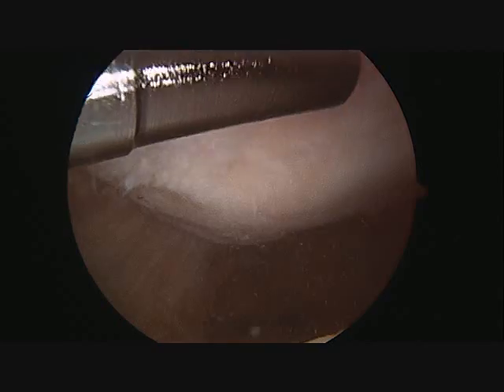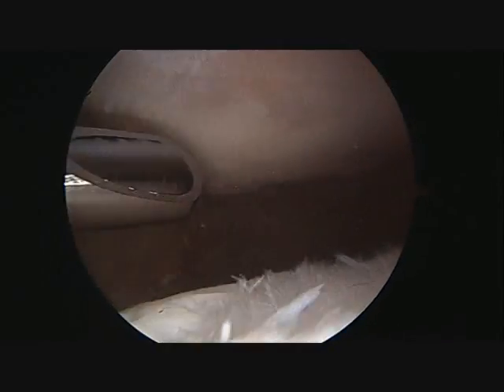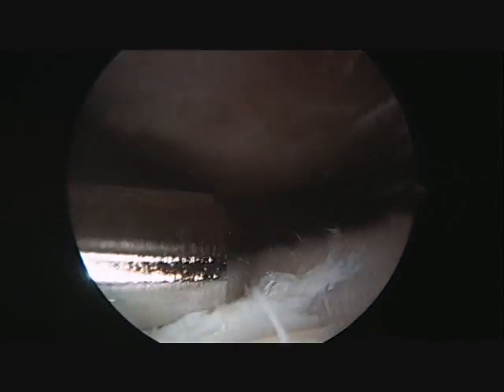The shaver is placed into the knee, and the rough edges are smoothed down to remove any loose debris, so as to eliminate a potential site for loose bodies as well as to reduce pain. This particular procedure is called a chondroplasty and is very effective for smoothing out rough cartilage.